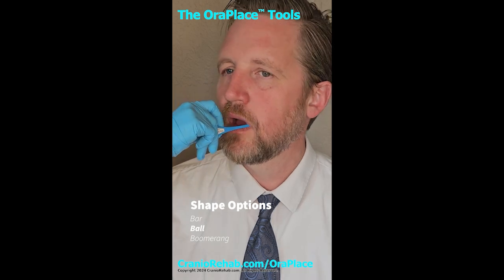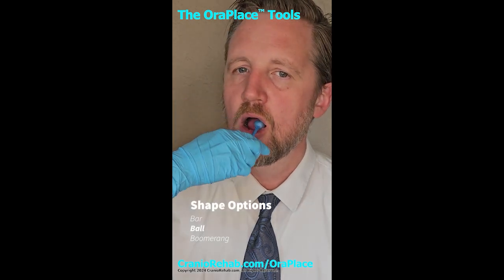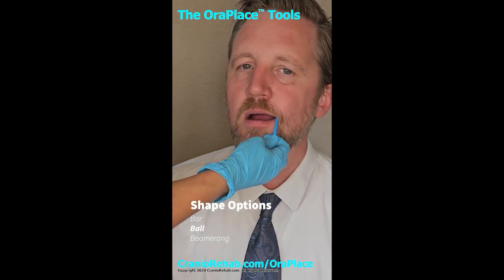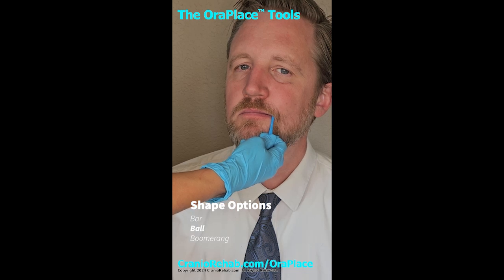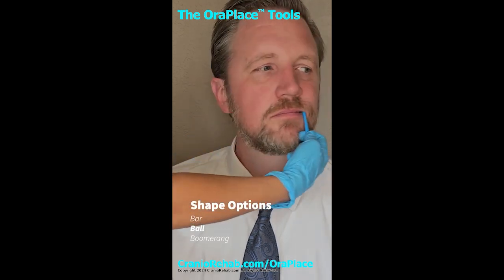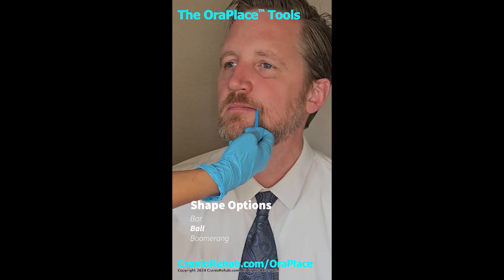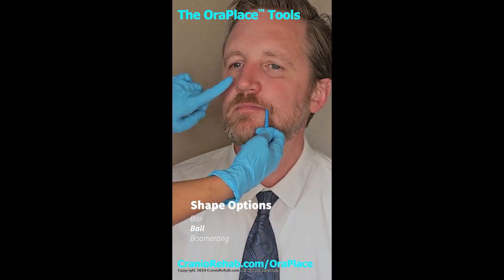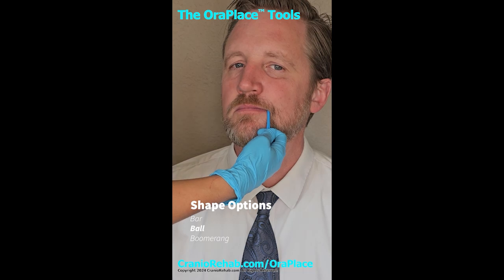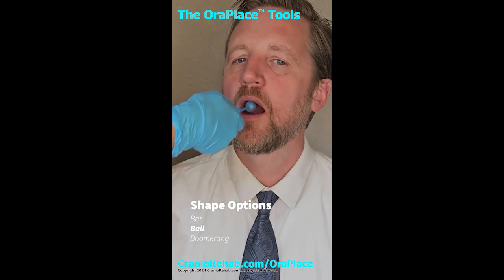Okay, open again. We're going to target now up by the nasolabial folds. The stretch is harder to see, but if you compare left to right, so go ahead and turn your head from side to side. You can see how much flatter it is on the right side of his face where we're not stretching. Okay, go ahead and open up.